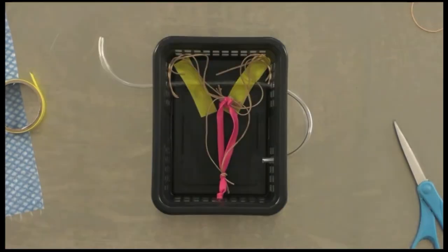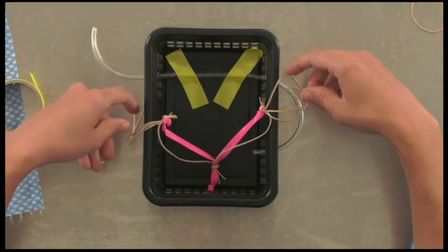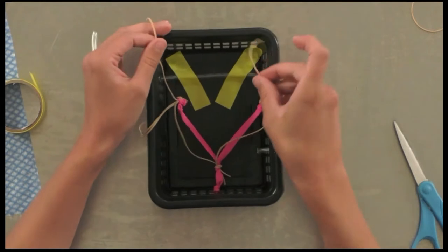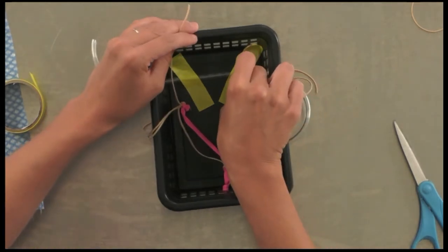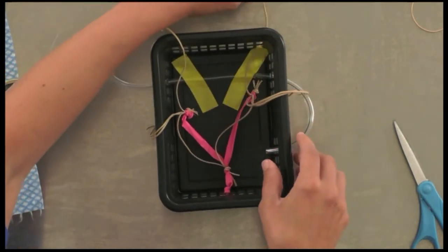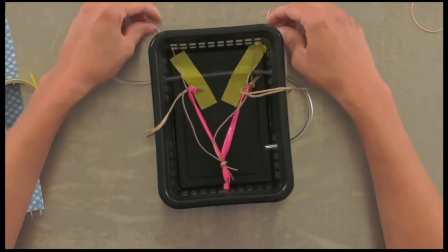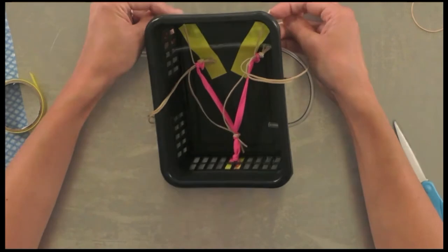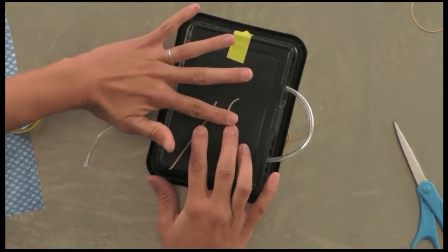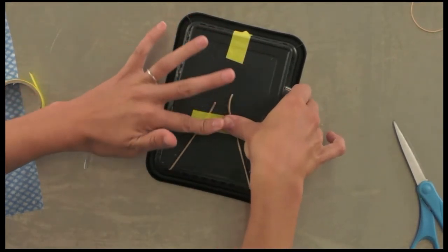Pick a strand — any strand — and that will represent your suspensory ligament. Insert those into the top lateral or corner aspect of the basket; you want these to be fairly taut. Flip your basket over and secure with some tape. There you've got your suspensory ligaments ready to rock.